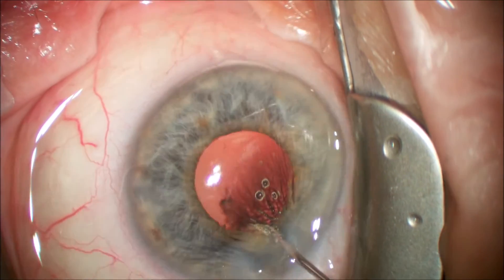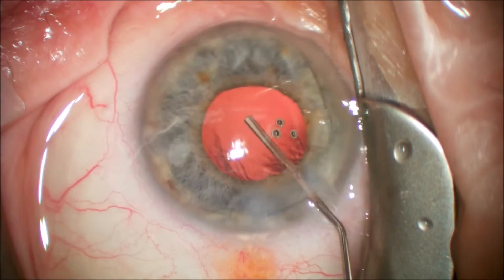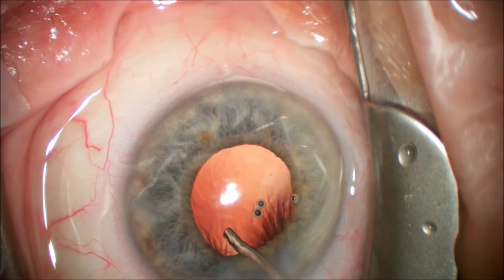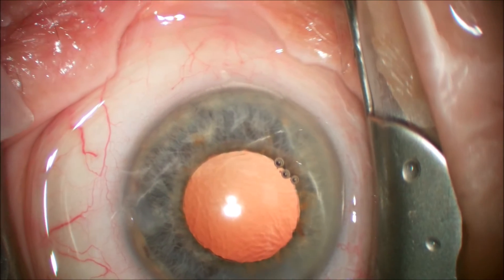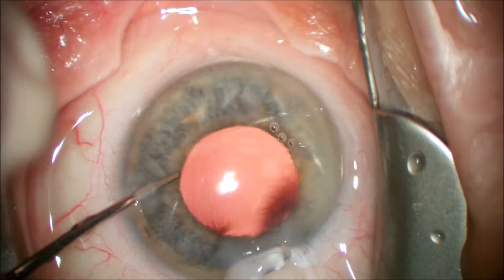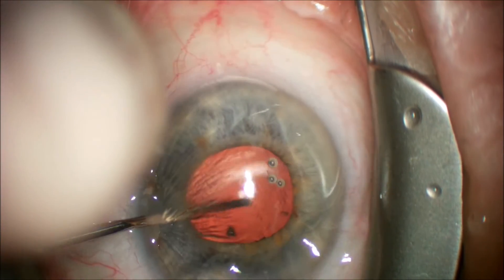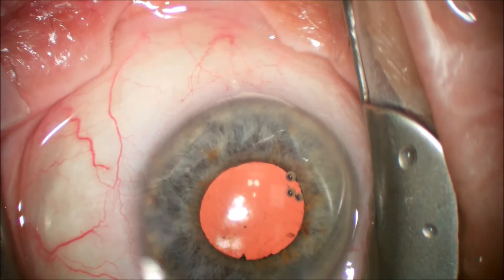We are going to inject a cohesive viscoelastic now to completely fill the capsular bag and the anterior chamber, and then we will implant our normal three-piece LI-61AO lens. The implantation of the LI-61AO lens is done in a two-step procedure: the first step injecting the leading haptic and the optic, and the second push of the plunger will place the trailing haptic inside the capsular bag. We will use the intraocular lens at the end of the case to perform a barrier between the cortical material and the posterior capsule to remove the remnants of the cortical material that is sub-incisional.